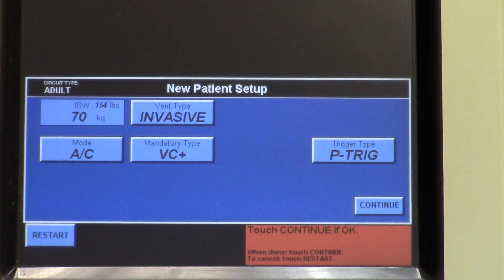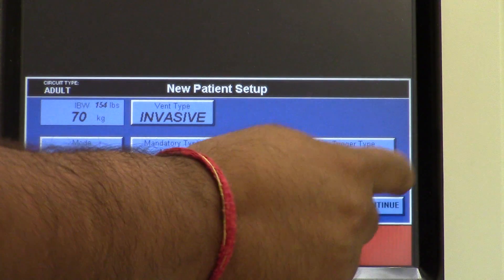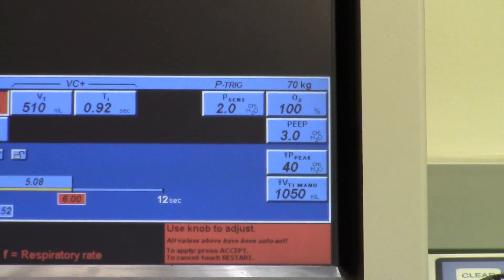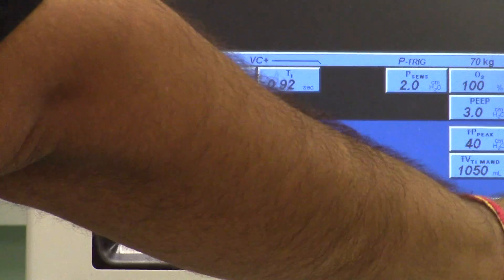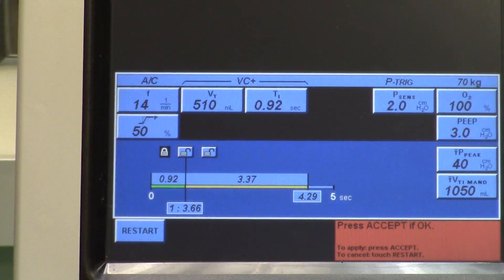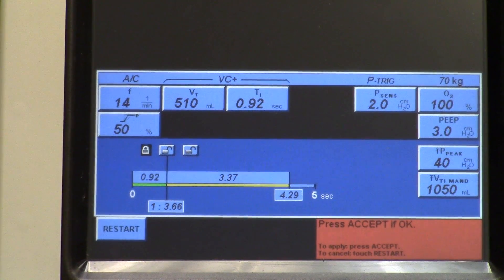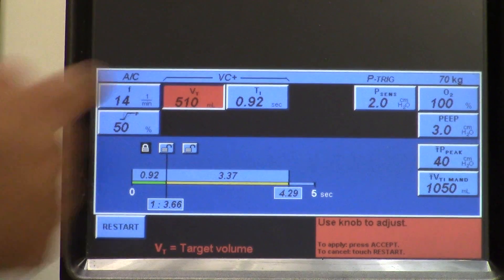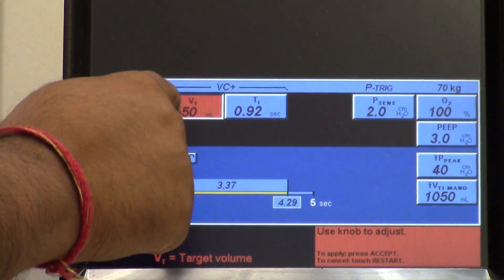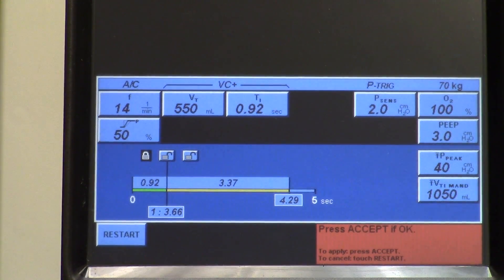Press continue to go to the next screen. For F, here is where you select the rate in breaths per minute that will be delivered to the patient — set that to 14. For tidal volume (VT), it's going to be 550.